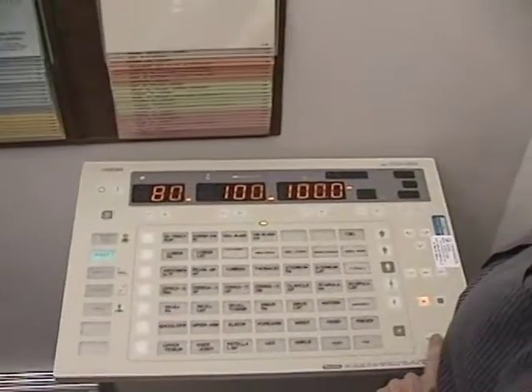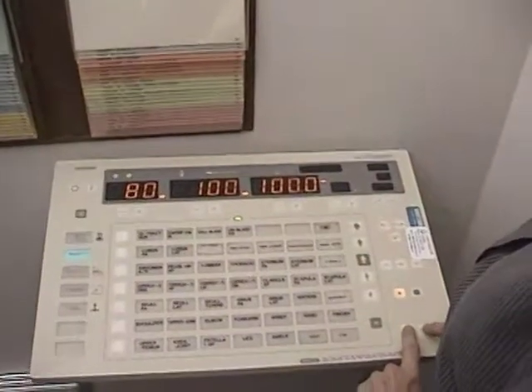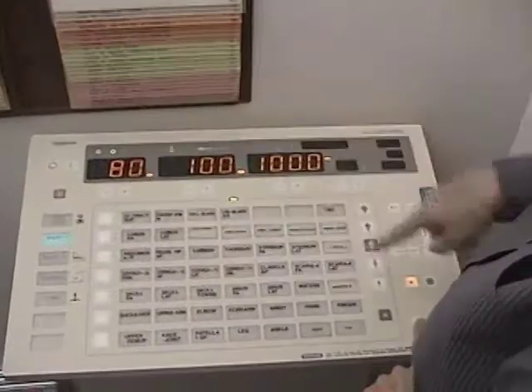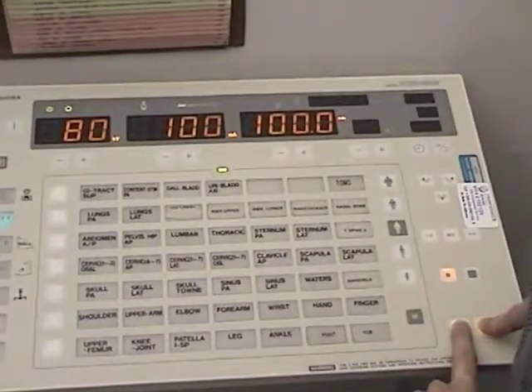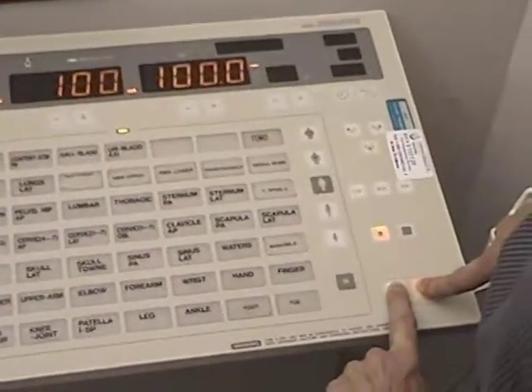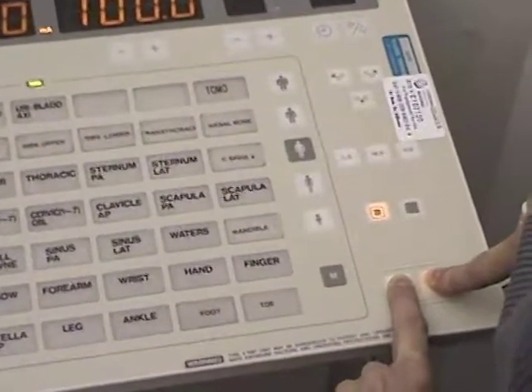So don't be afraid to keep your finger on the button. You push ready. You have it come up to speed here. And now you're going to look for the indicator light that says you're making an exposure. And now you see my finger, it's still on the button. But there's no more X-rays coming out because the timer stopped the exposure. You don't have to be afraid of it.